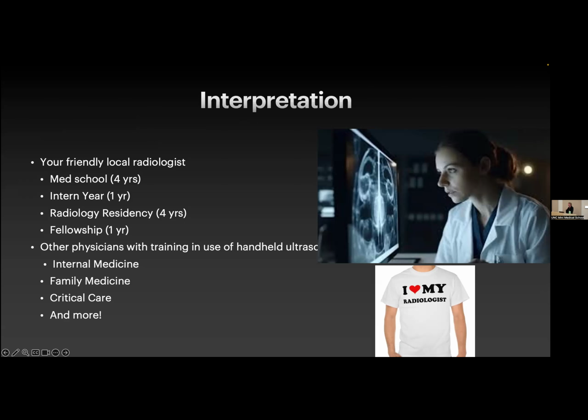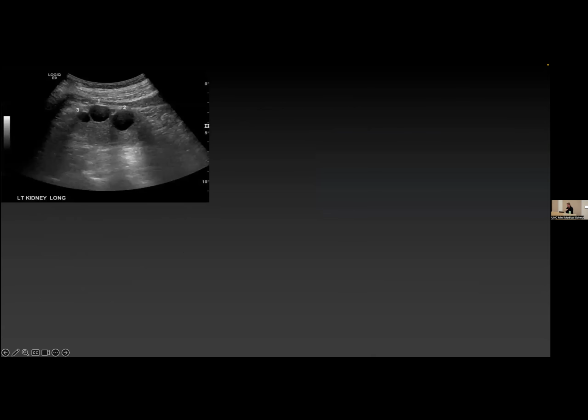They're looking at the images in real time. They're taking the pictures themselves. They're seeing, is there blood in a trauma patient? Do I need to go on and get a CT right away, or does this patient not need a CT? Can we avoid it? So it's no longer just a radiologist who might be reading that ultrasound. If it's just a point of care ultrasound, it might be the clinician who's treating you at the bedside. And then all those images and the interpretation are put together into a report, and that goes into the electronic medical record. Let me make sure I'm on time here.